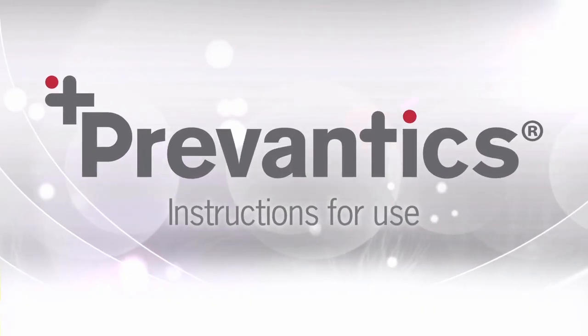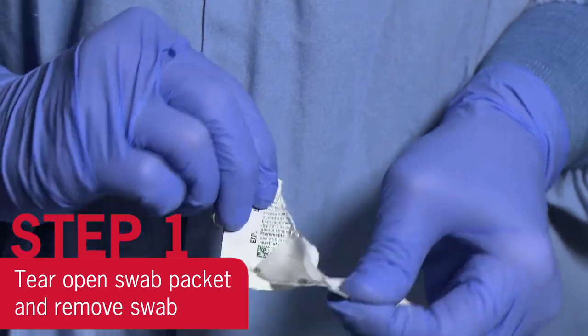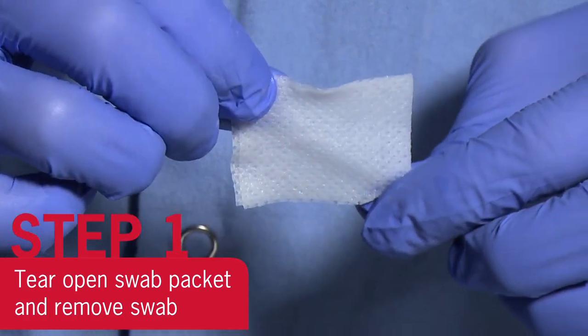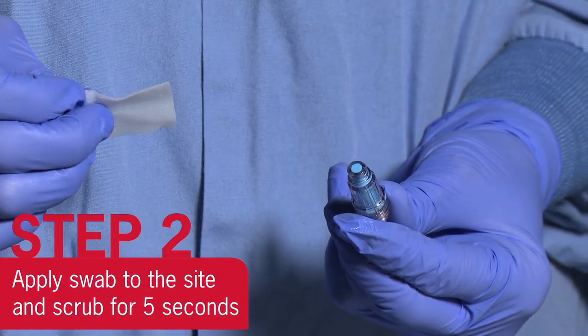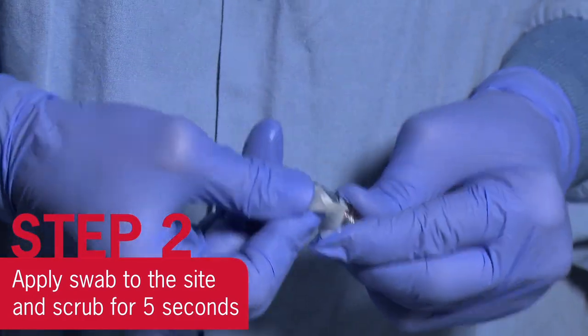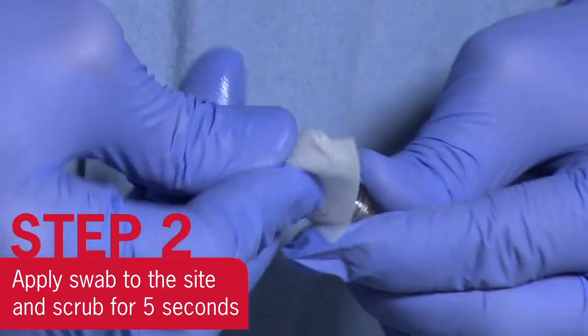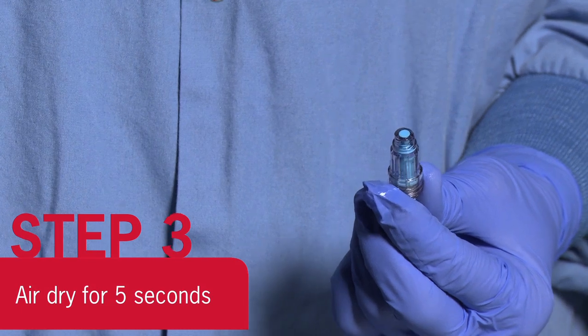Here are the instructions for use. Tear open swab packet and remove swab. Do not unfold swab. Prior to injections, apply swab to the needleless access site of the device by holding swab between the thumb and index finger and scrub using repeated back and forth strokes for 5 seconds. Allow to air dry for 5 seconds.